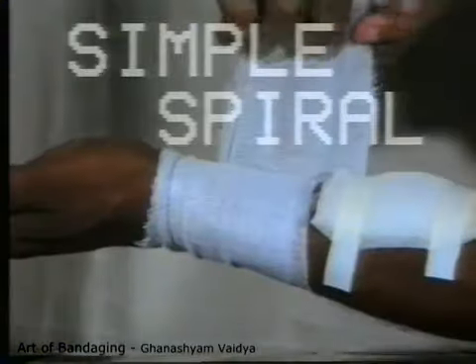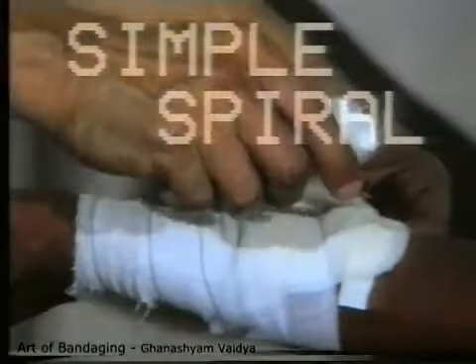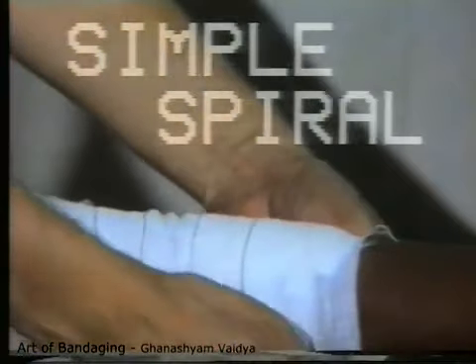Now let us study the 4 basic techniques of rolling the bandage. Simple spiral. Here, after fixing the bandage, it is rolled in a spiral form. Each turn covers 2/3 of the preceding turn and is parallel to it. It is rolled from narrower portion to the broader portion, that is from the distal end of the limb proximally.